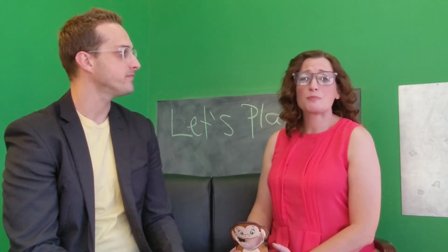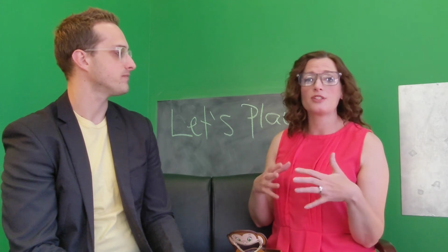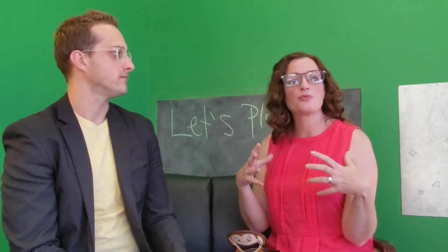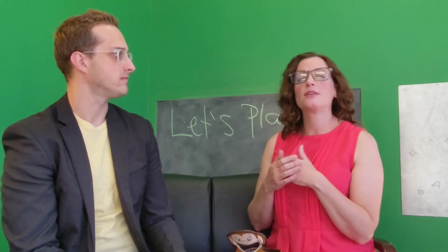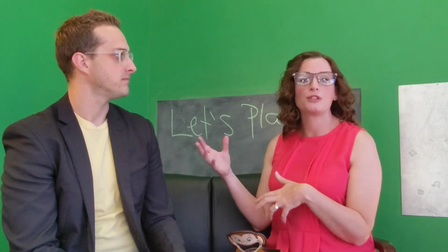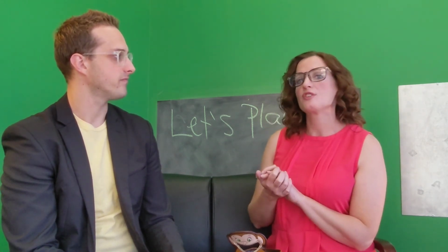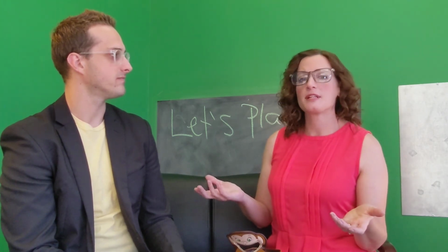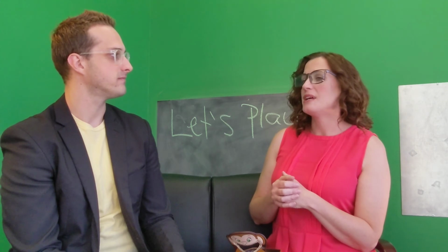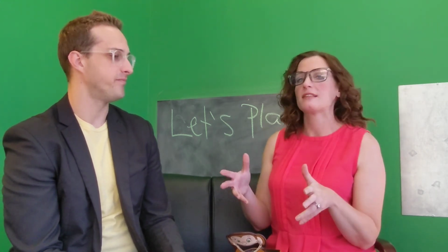Yeah, and it's perfectly fine and normal for an audiologist, in the very beginning, when we're just in the room talking, to think, okay, I think your child's a good candidate for this type of testing. We're going to practice here in the room. We're going to go in the sound booth. We're going to practice. But then having to switch gears depending on your child. That doesn't mean there's anything wrong with your child. Everybody responds differently. And if you've got a good audiologist, they're going to know, okay, time to switch gears. We're going to try this now.